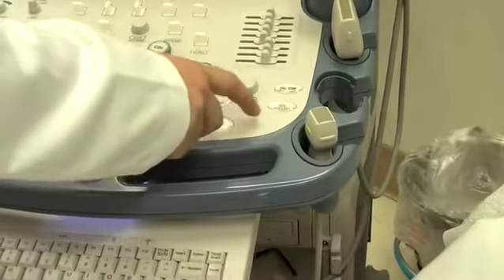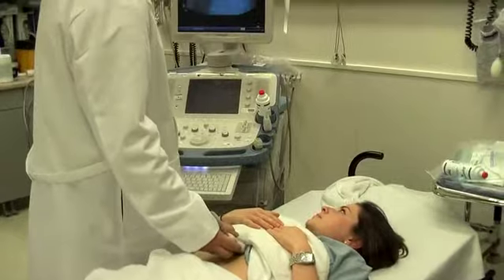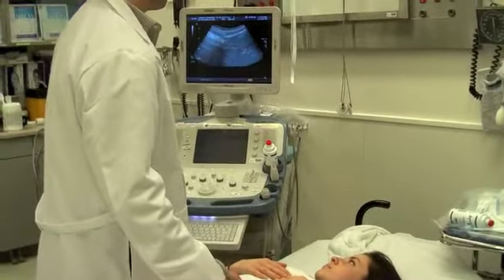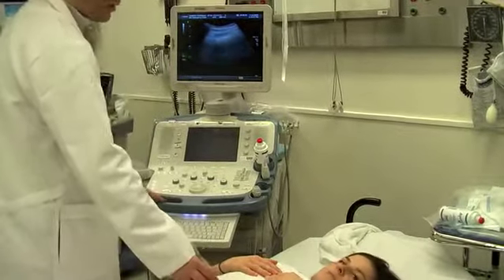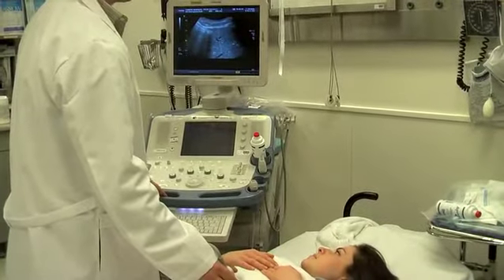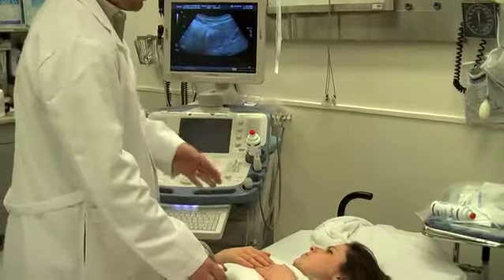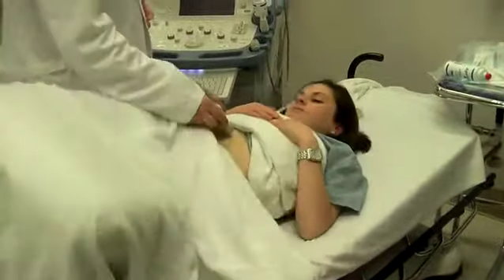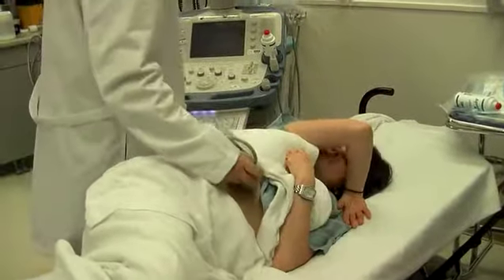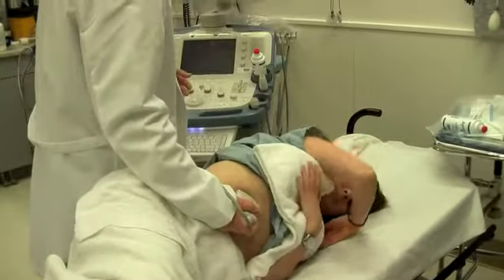So we're picking up a lot of gas from the duodenum. The C loop of the duodenum sits right in the same area. And anytime, air is the ultrasound enemy, it scatters ultrasound everywhere and makes your picture look not so resolute. So a good way to do this is to roll the patient on the left side. So go ahead and do that for me. That takes all of the bowel contents and moves them gravitationally dependent towards the bed, and it brings the gallbladder fossa out from underneath the rib cage and gets all that bowel gas out of the way. So you can see how I have a little bit of a better picture here.